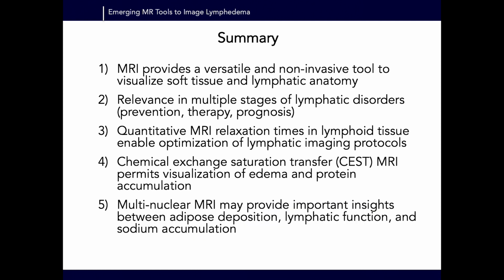All right, so just in conclusion, MRI provides a relatively versatile and non-invasive tool to visualize soft tissue and lymphatic anatomy. And you don't need to inject anything necessarily. And all the scan times are generally less than an hour. That's relevant in multiple stages of lymphatic disorder. So you can look at prevention, identifying candidate lymph nodes for dissection, evaluating therapies, and then also for prognosis.